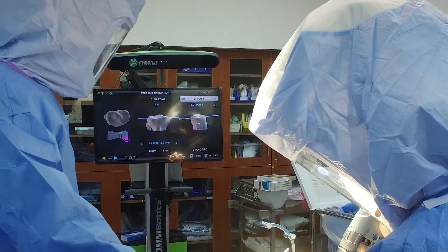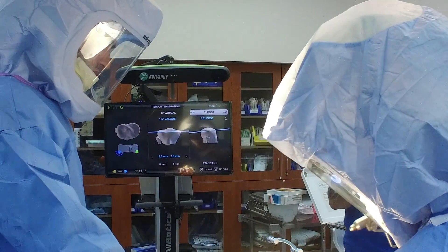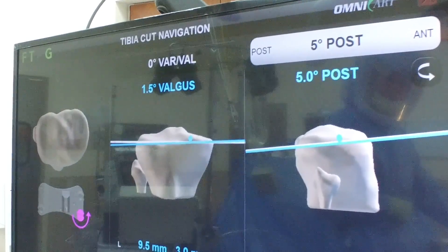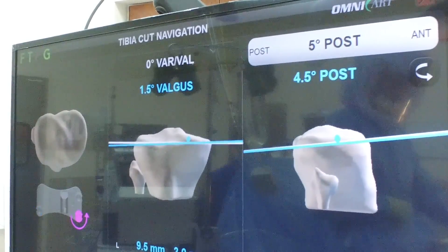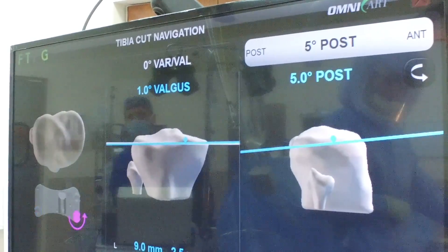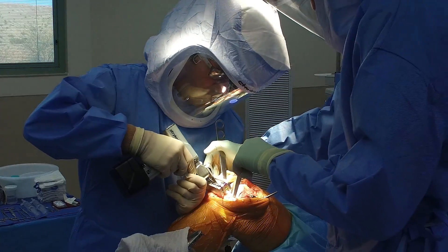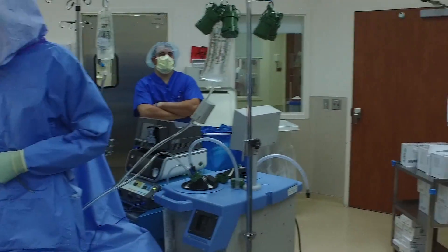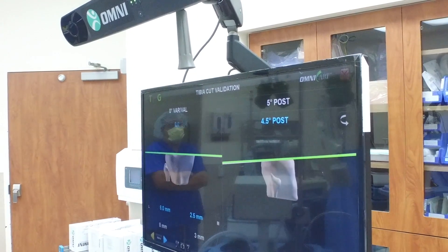The first thing we'll do is decide how we're going to make our tibial cut — typically perpendicular to the axis of the bone. You see that white line? We dial that in and decide where we're going to cut. As we pin the cutting jig in place, we perfect it — turning the screws until we get that line green, which tells us we're right on. Then we make that cut exactly where we planned. The Omni system then allows us to put a sensor on there and confirm that the cut is exactly what we wanted — we can see that green line reproduced.